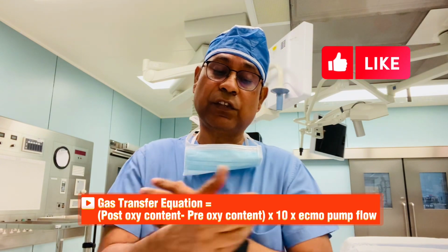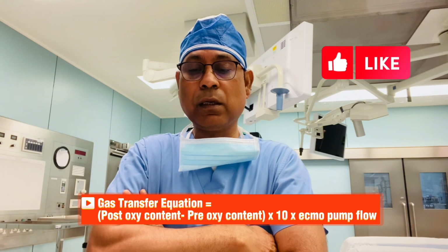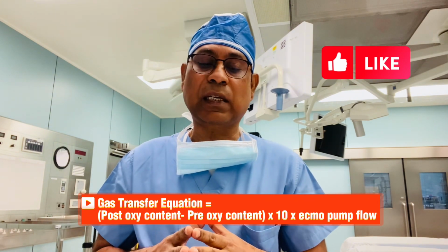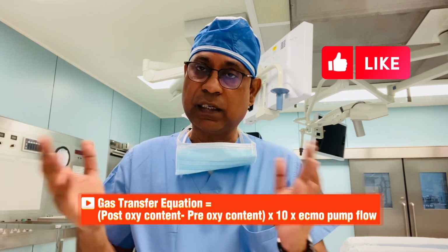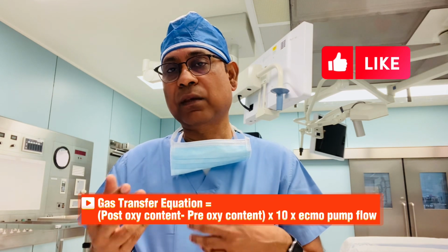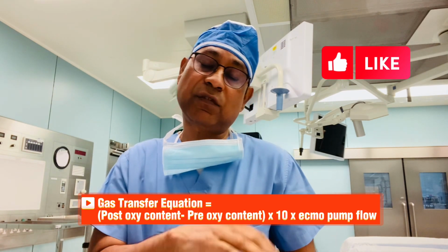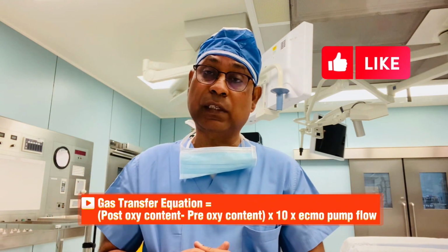So the equation is: post-oxygen content minus pre-oxygen content, times 10, times the ECMO circuit blood flow. If you want to get the value of oxygen transfer in the membrane, we need to know the oxygen content.